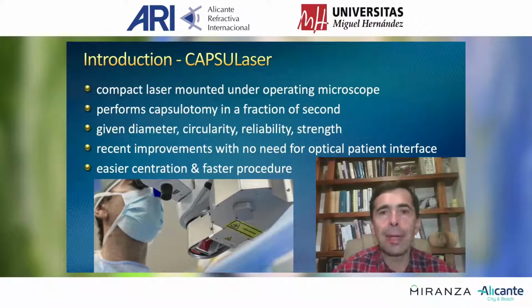It performs capsulotomy in a fraction of a second, and the capsulotomy has a given diameter. It's circular, reliable, and strong. The recent improvements of Capsulaser enable us to use this laser with no patient optical interface, which makes the centration easier and the procedure faster.